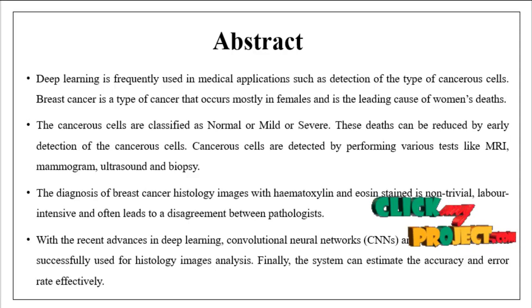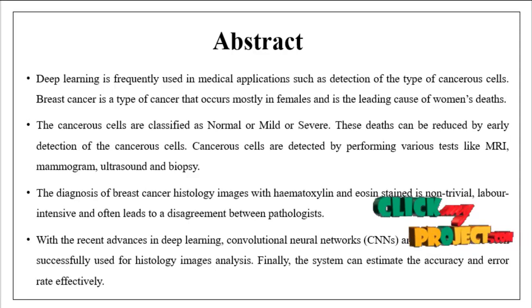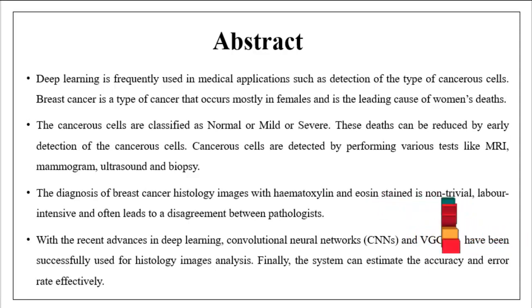have been successfully used for histopathology image analysis. Then finally, the system can estimate some performance metrics such as accuracy and error rate. So, this is the overview of our project.